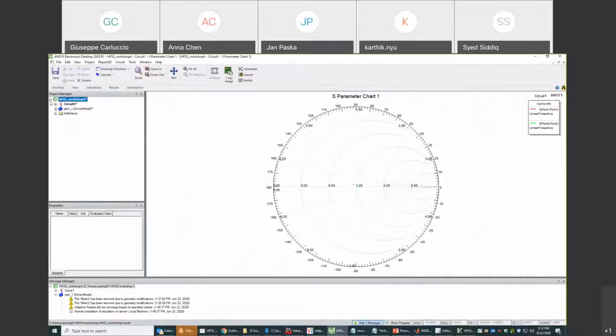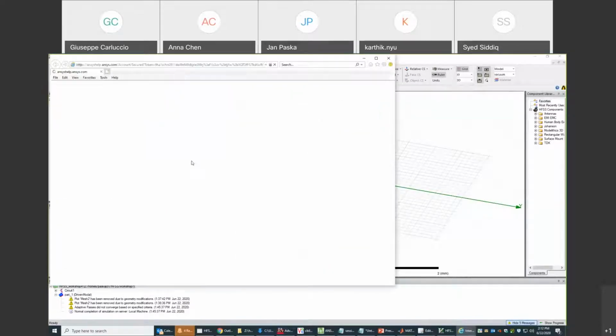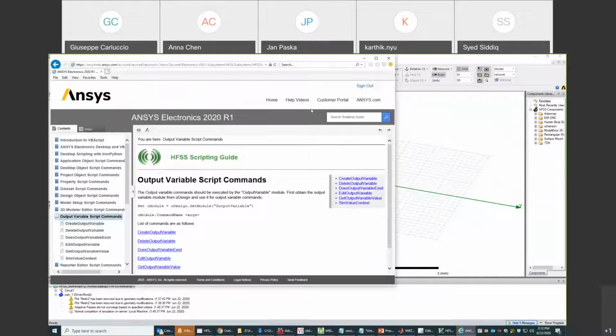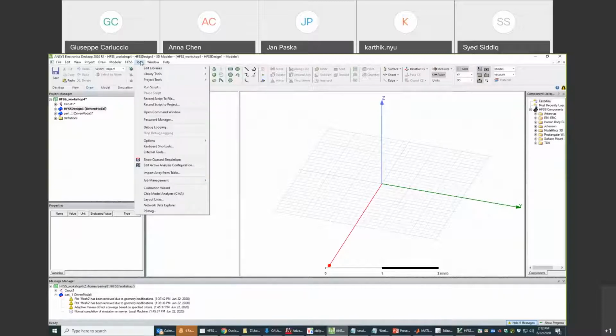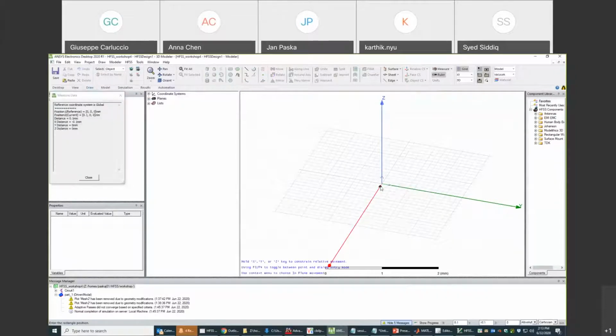And now let's talk about scripting in HFSS. I'm gonna open a new design for that. So how I do scripting, I mean, probably in the help menu there is scripting help, and you can look up all the different commands that are needed. What I prefer doing is to use this function. You can select tools in the menu bar and select record script to file. You can give it a name, Workshop 4. And then you can just draw whatever you want to draw.